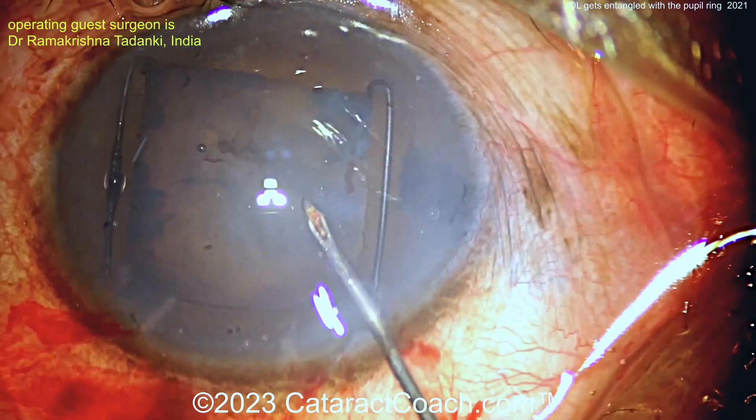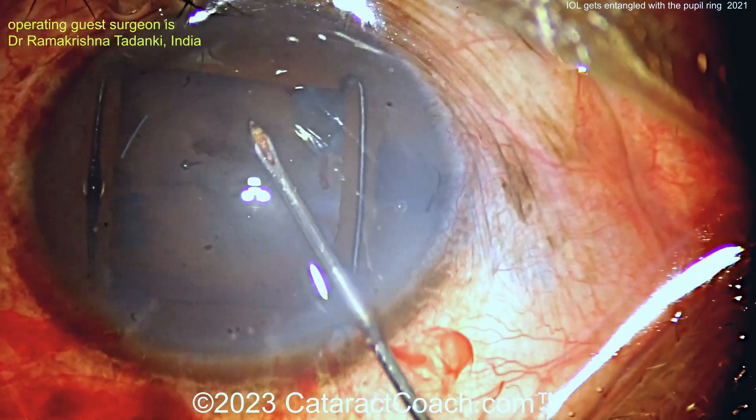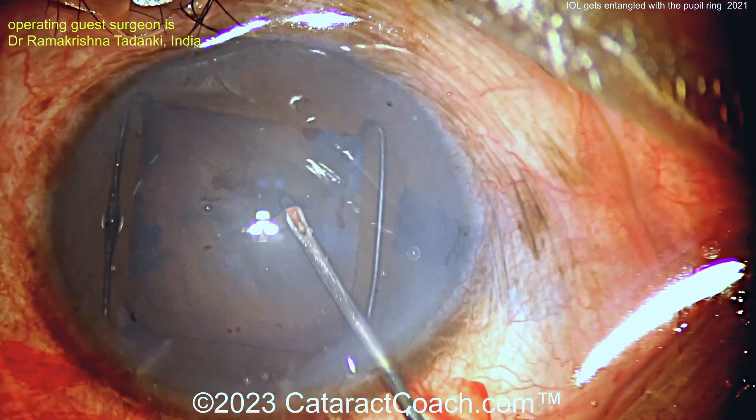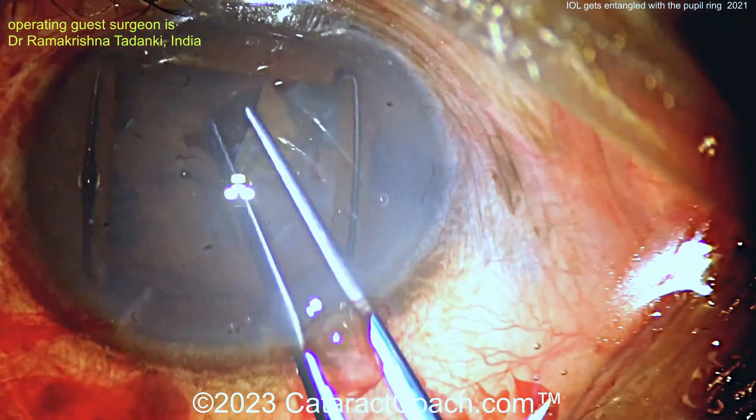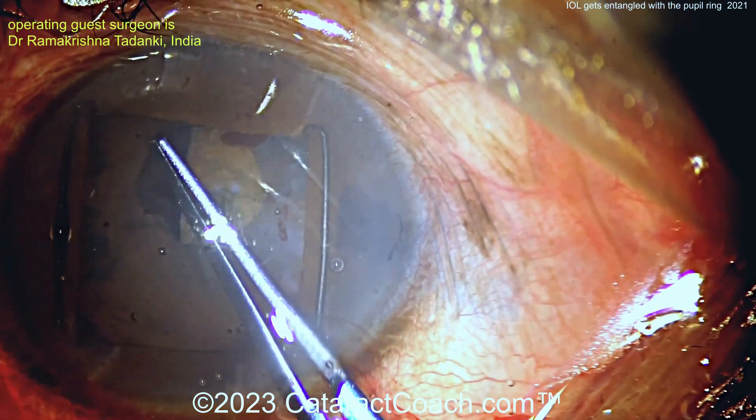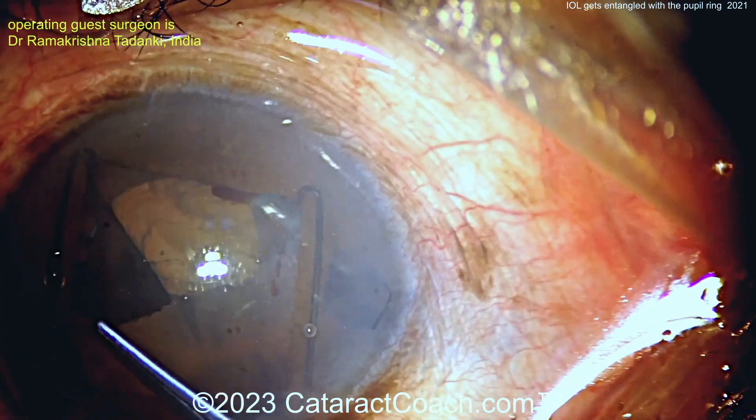Nucleus removal is going to be pretty straightforward. Using a cystotome here to start a rhexis and get it going. In a case like this, you'd make a sufficiently large rhexis, still aiming for your five or five-and-a-half millimeter rhexis.